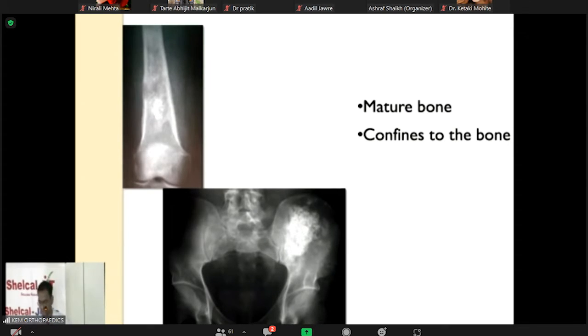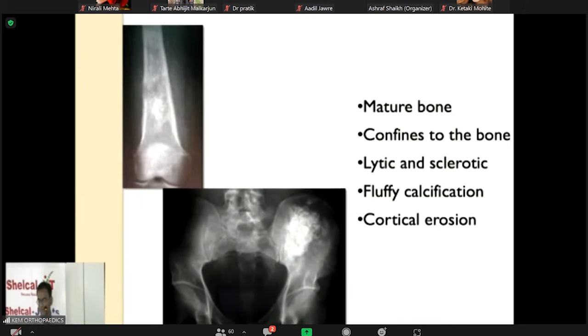This is an X-ray of distal femur and pelvis with both hips in a skeletally mature patient with adequate exposure. There are punctate calcifications in the metaphyseal region with lytic and sclerotic changes, and in the left iliac bone. Most likely to be a chondrosarcoma. Correct.